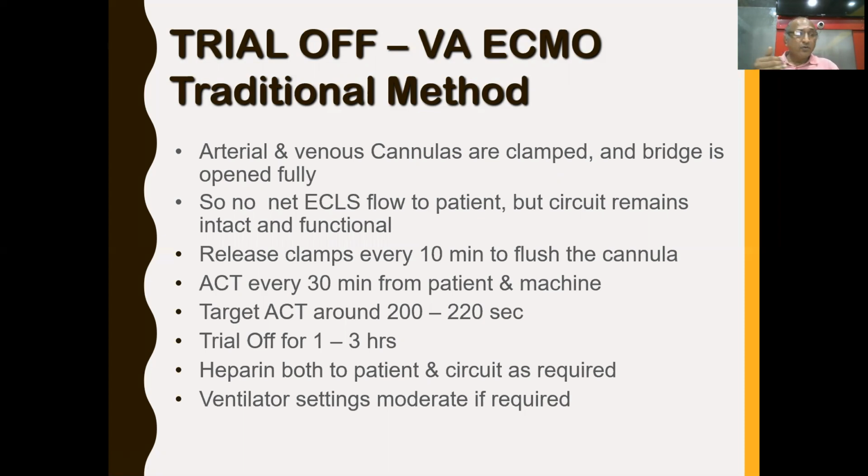You have to target ACT on the higher side because we are clamping the cannulas, but the circuit is on. And this trial off should not be more than 1 to 3 hours. You have to give heparin both to the patient and the circuit, and ventilator settings should be moderate if required.